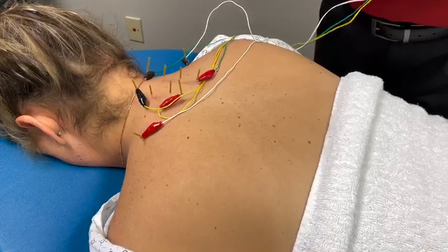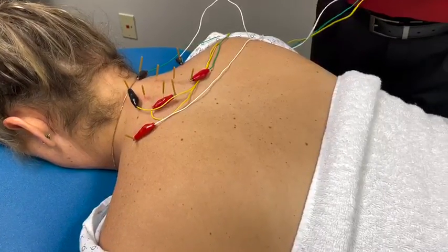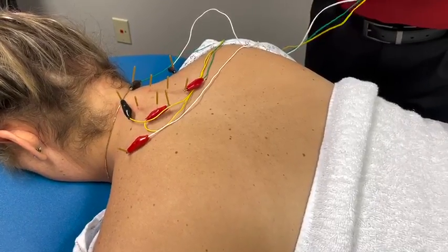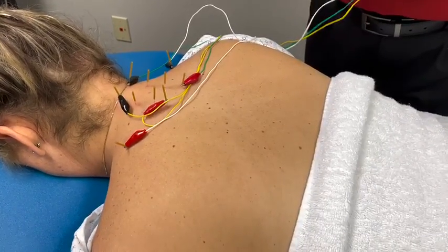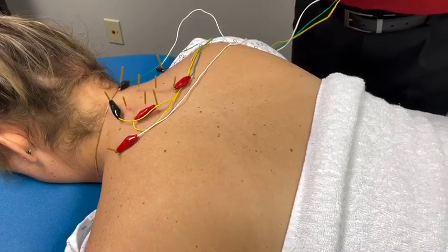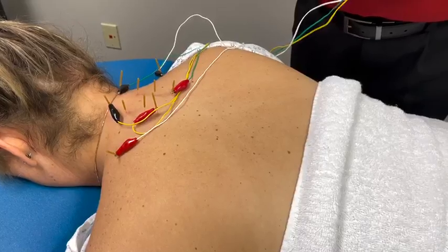And it's a kind of weird feeling for the patient, because the patient's not contracting, but see how it goes and makes her kind of shrug her shoulders. So that's in her upper traps. And the more she takes, the better the treatment would be. So we do this for 18 to 20 minutes. Then we pull the needles and then we put a heat on it for 10 minutes.